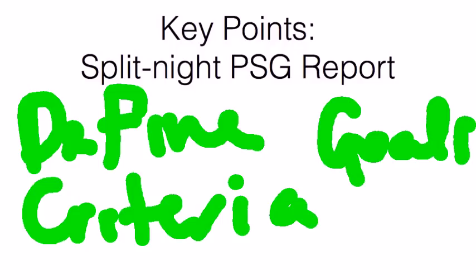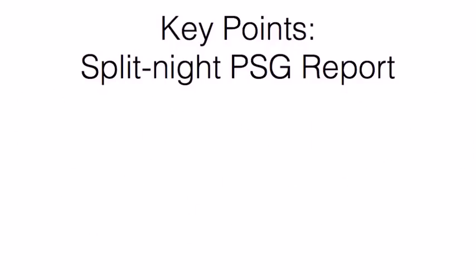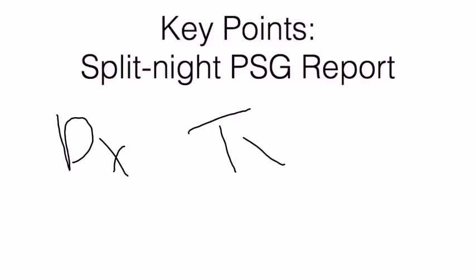Alright, let's get started. The definition of a split night is where the patient undergoes a diagnostic portion of the sleep study, followed by a therapeutic portion of the sleep study. The diagnostic portion is what the patient undergoes initially, where they are hooked up with all the monitors, and nothing is done except observation of their sleep, breathing disorders or any other abnormal sleep behaviors or even leg movements and so on.